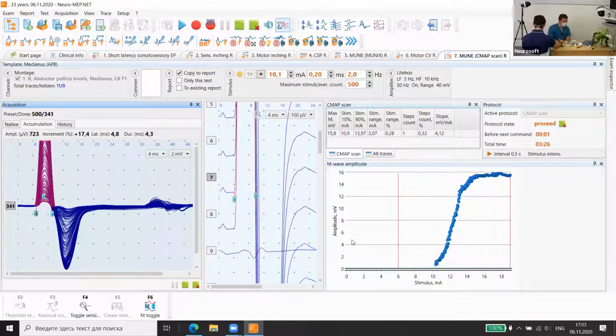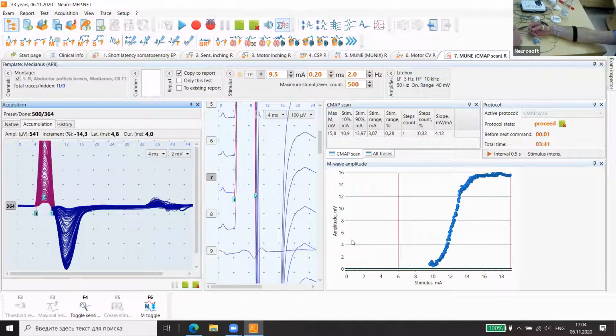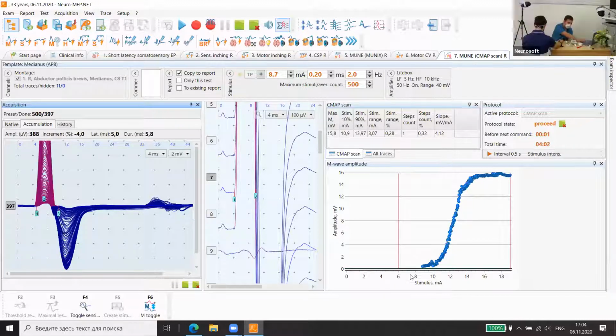Let's wait, it's soon finished. Already the contraction of the muscle is much lower. A little longer. And now there are different methods to estimate these steps. Mostly now it's scientific research, mostly to estimate, for example, amyotrophic lateral sclerosis.